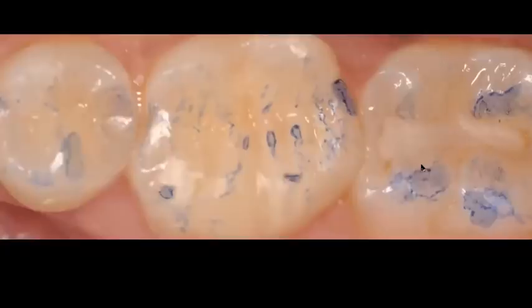Now, I want you to look at the difference here between my restoration and the existing restoration on the second molar. As you can see, this horizontal composite layering technique that was used to restore this second molar has no effect on the occlusion of the patient. The patient is not even touching that area. Of course, because if I place a horizontal layer and it's thick enough, the patient is going to hit on it. So what do I have to do later?